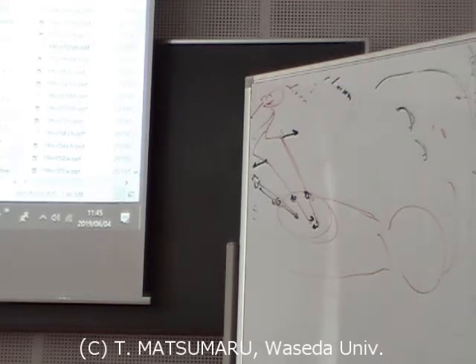The robot has at least 3 arms, 2 for the two hands and 1 for the vision. The Da Vinci system went from the standard, to the next one, the third one, and presently the Da Vinci Xi surgical system is used. The earlier video was this one, What is Robot Surgery, a promotional video. Let's watch.